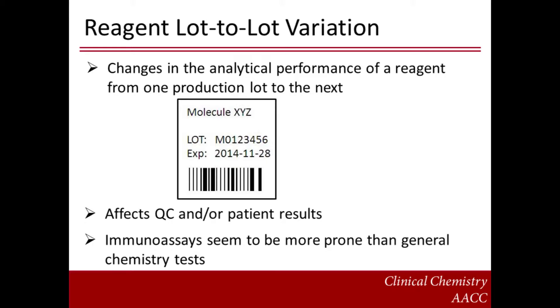Reagent lot-to-lot variation may be defined as a change in the analytical performance of a reagent from one production lot to the next. Here we use the term lot to mean a batch of reagent produced by the manufacturer under uniform conditions and passing as a unit through the same series of processes. While some lot-to-lot changes only affect QC measurements, others may simultaneously affect patient results. The limited commutability of QC materials with patient samples, however, means that the effects of the new reagent lot on the patient results cannot be predicted from the behavior of the QC measurements.